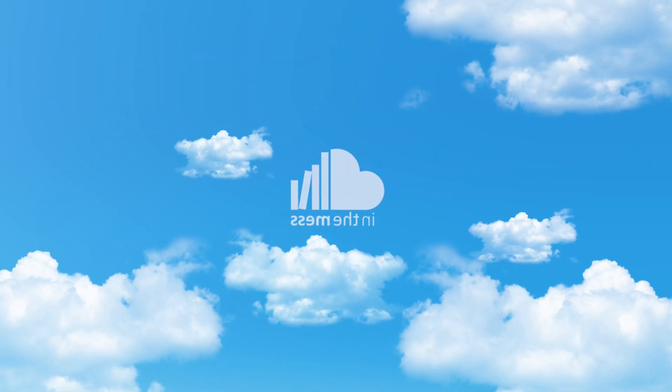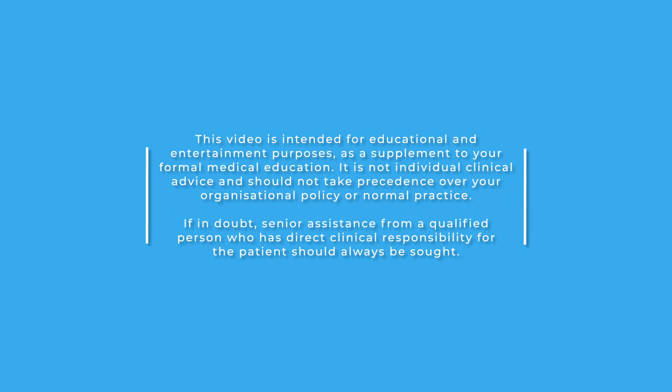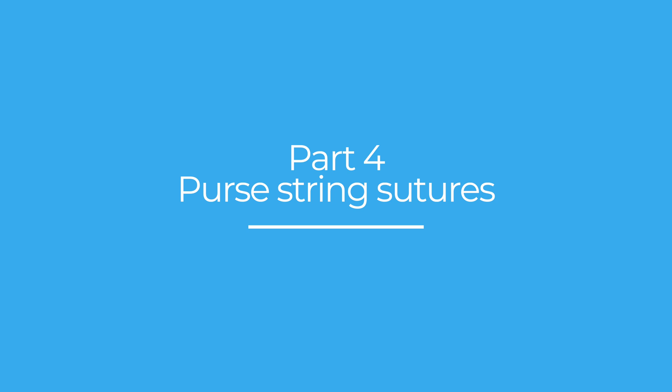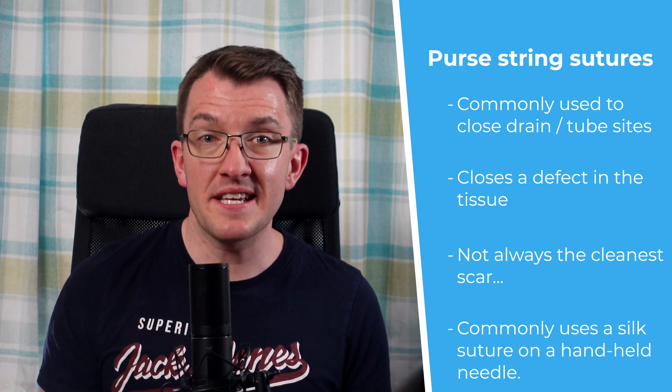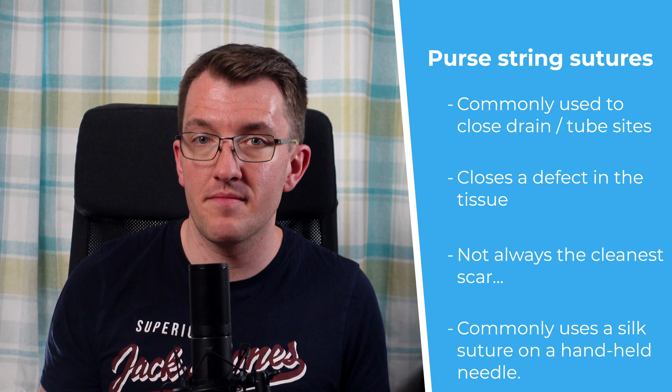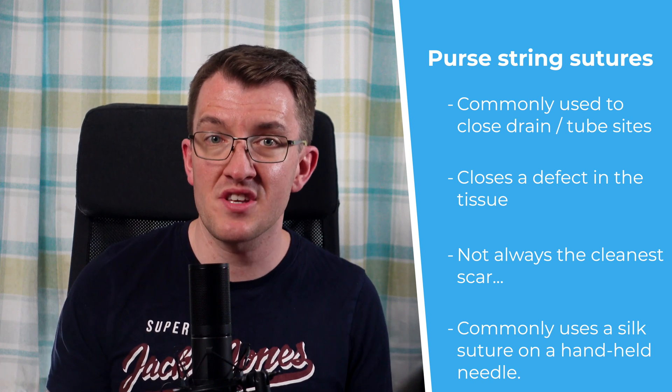Here's step three of our suturing mini-series and a slightly different technique to have a go at: the purse string suture. Purse string sutures are quite niche, but are still used quite a lot in clinical practice. The commonest thing they're used for is closing wound drain sites, chest drain sites, or old feeding tube sites. This technique is designed to close a defect in the tissue by essentially puckering it up. You have to be mindful that it may not result in the most cosmetically appealing scar, so if in doubt, check with your senior before embarking.